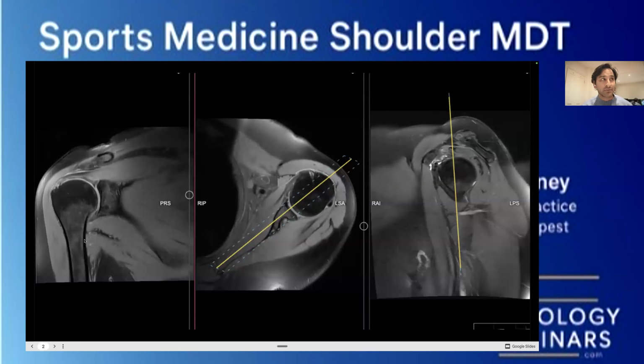Therefore, anything that's black on this particular image is going to be cortex. But other things that are avascular are also going to have a very black appearance. So tendons, by definition, don't have very good blood supply, don't really have much going on unless there's something wrong. They're also going to look very, very black. And if it doesn't look black, then that's something that you should be worried about.